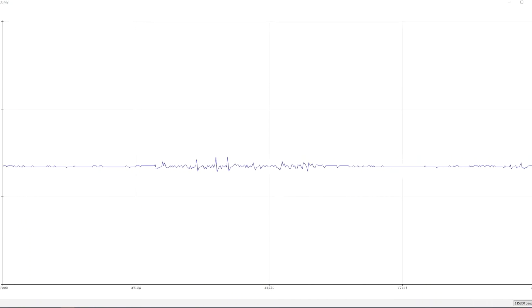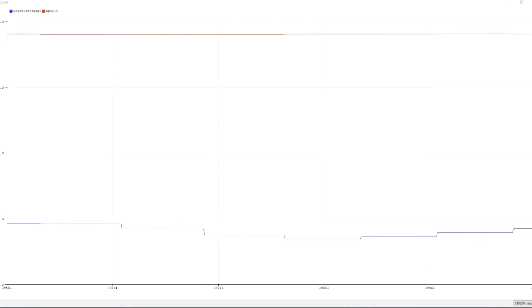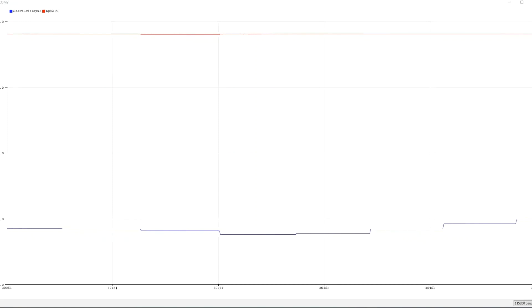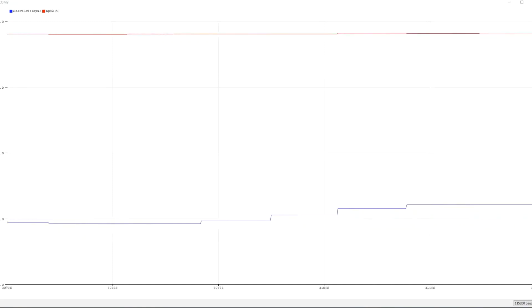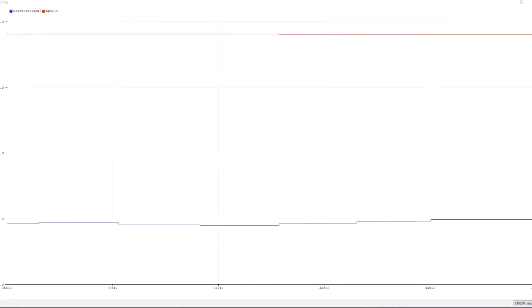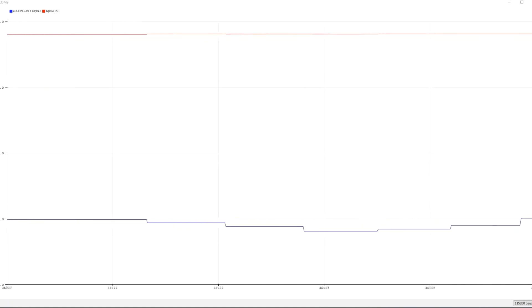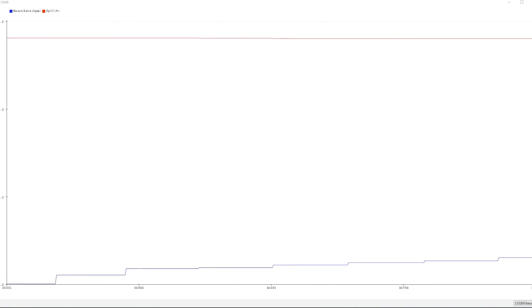We can also measure oxygen level and heart rate to detect sleep apnea. The red line is the oxygen level and the blue line is the heart rate. During normal breathing, the oxygen level is relatively stable. When someone holds their breath, we can see the oxygen level getting lower because no air is passing, and the heart rate also changes. Most notably, the oxygen level is clearly decreasing.